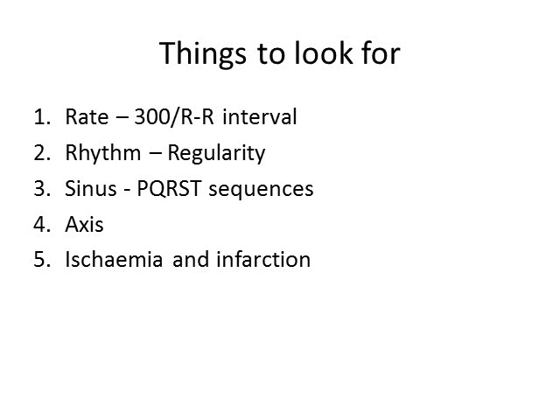Axis, a lot of people get very het up about axis. I think in clinical practice, it's not as important as it is in textbooks, but you need to know it for OSCEs in order to be able to talk about it if you're talking through an ECG. And I'll quickly go through axis tonight, but I won't spend any great deal of time on it. And finally, ischemia and infarction, because particularly infarction is the one thing you don't want to miss on an ECG.